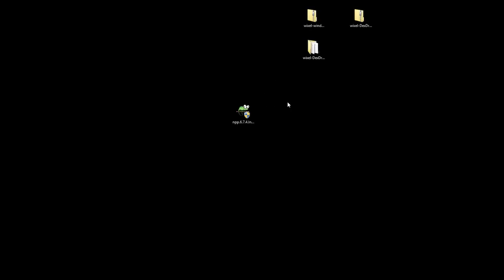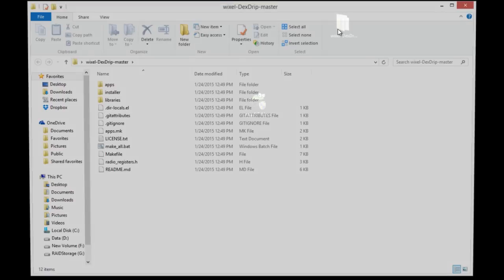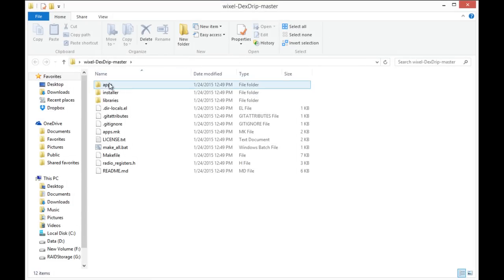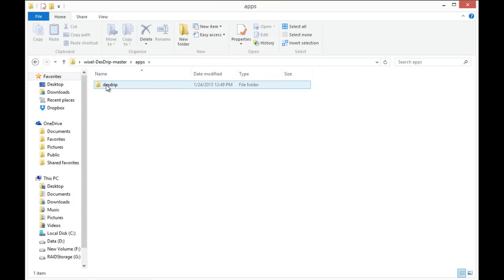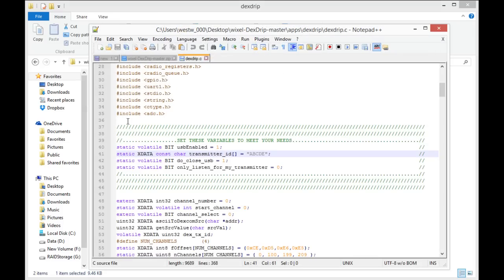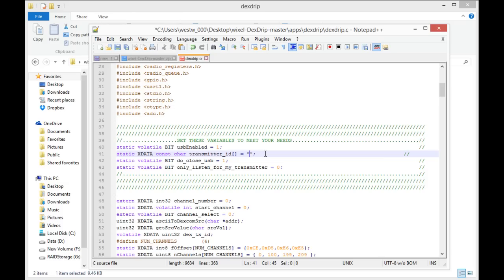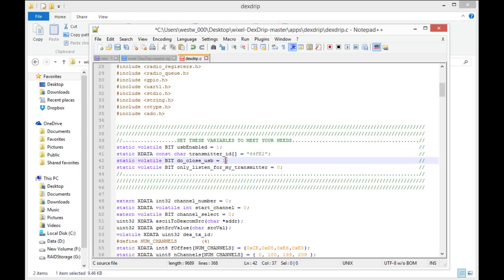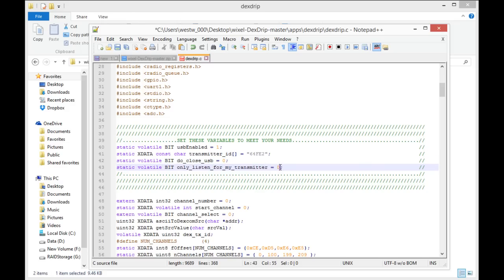Next thing we'll do is navigate to our extracted file. You go into apps, and into DexDrip, and then to the dexdrip.c file. Edit that with Notepad that we just installed. And those four lines there are what we need to modify for our own needs. So I'm just going to go ahead here and put in my transmitter ID. I have to use capital letters. USB enabled should be set at 1. Do close USB at 0 if you want to write to the Wixel again, or 1 if you want to save battery life.